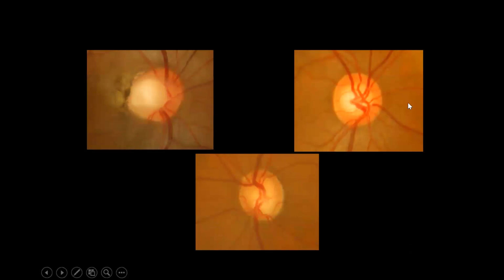Thank you very much, Doctor. Whenever you are assessing an optic nerve head, you need to make sure about some variabilities, some abnormal features of the optic nerve head that you might have, and don't always be occupied by glaucomatous damage. Khalid, I need a volunteer, please, just for a quick comment on these optic nerve head slides. Walid Sarhani.